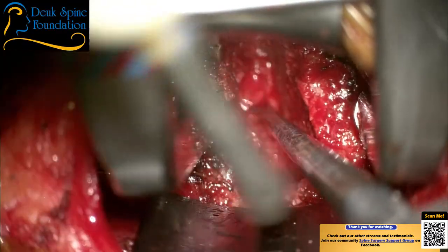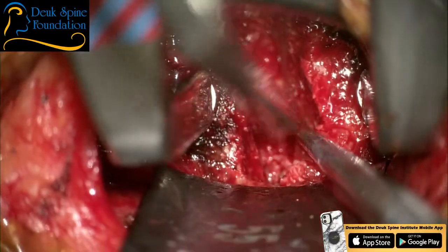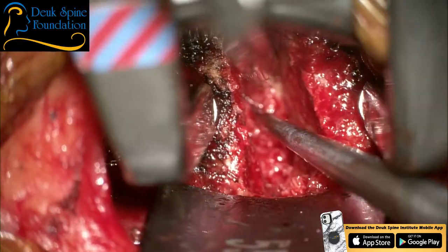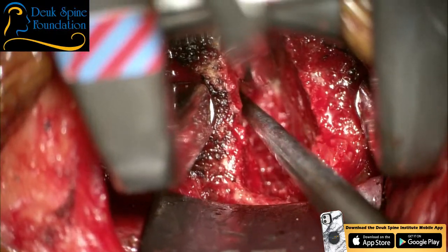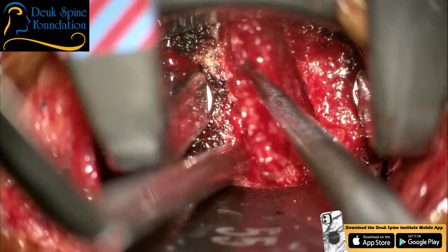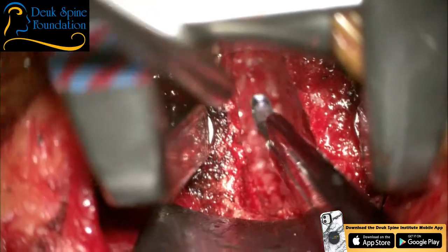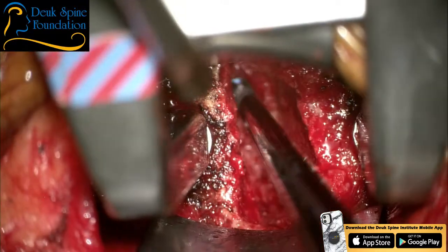Any more questions, Sean? Suck please. Suck this. Yeah. What's the regular size cage that we do? Oh. Yeah, he's got kind of a wide disc space. Is there a template? I can't see. Is there a template I can use to figure it out? All right. Harrison? I can't tell you right now. I don't know. Wipe?